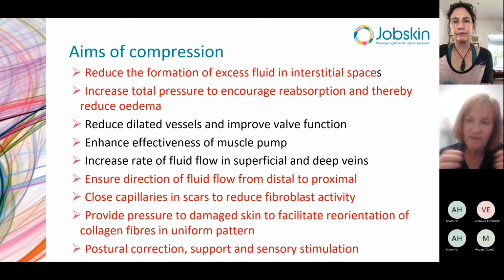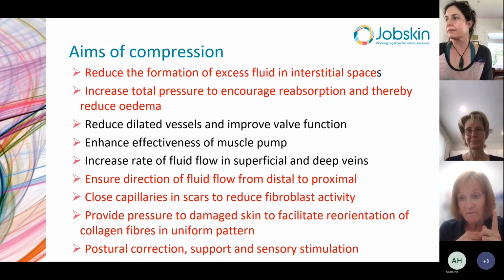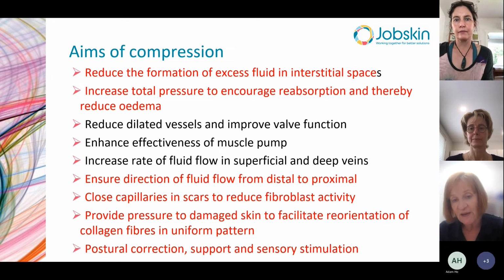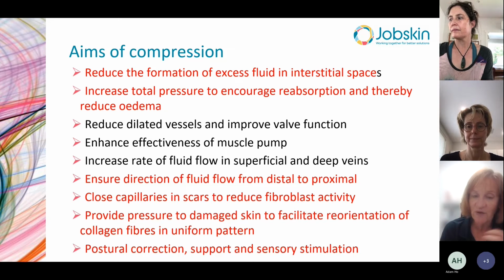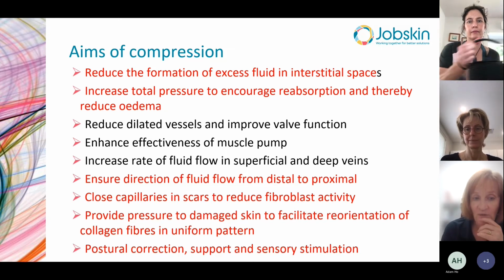By comparison, in the case of lymphedema, the primary purpose is managing and controlling the lymphedema. We don't necessarily need to provide pressure to damaged skin, or try to correct posture, but with multi-trauma, we might be ticking all those boxes.